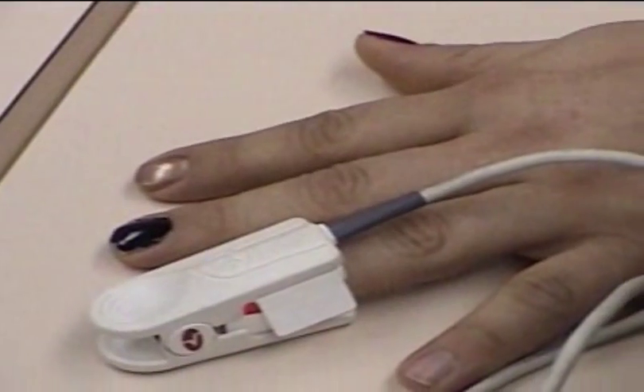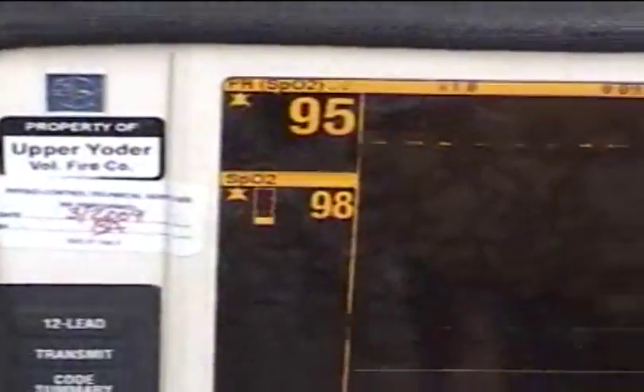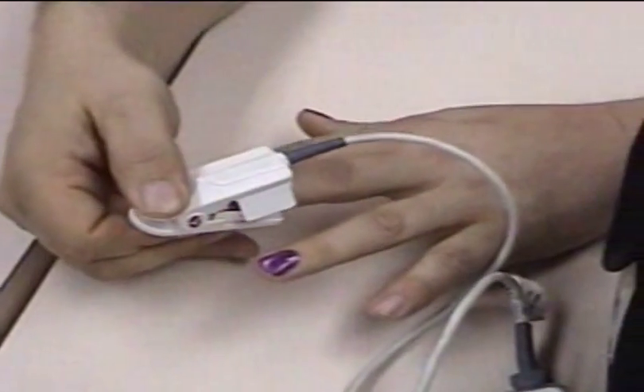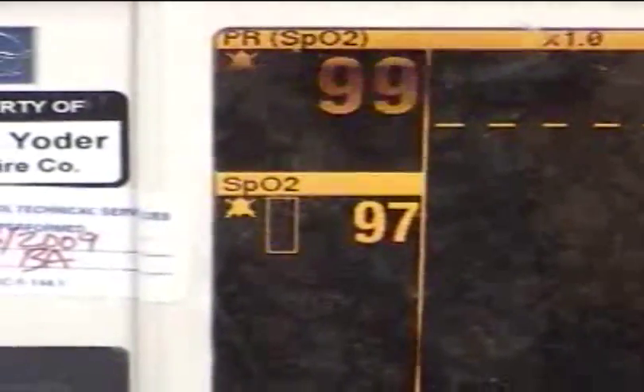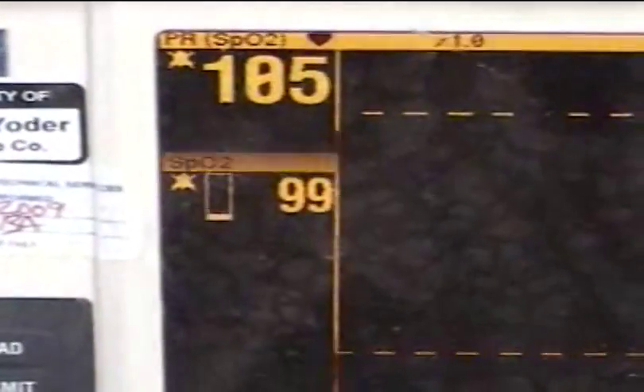Everybody's tachycardic. I'm just nervous. Now we go to purple — so there really is nail color there, and he even put it on thick. 98%. Next, I'm black — now we go to black. Do you still chew? Yeah. That's a 97%, then 98%, then 99%.